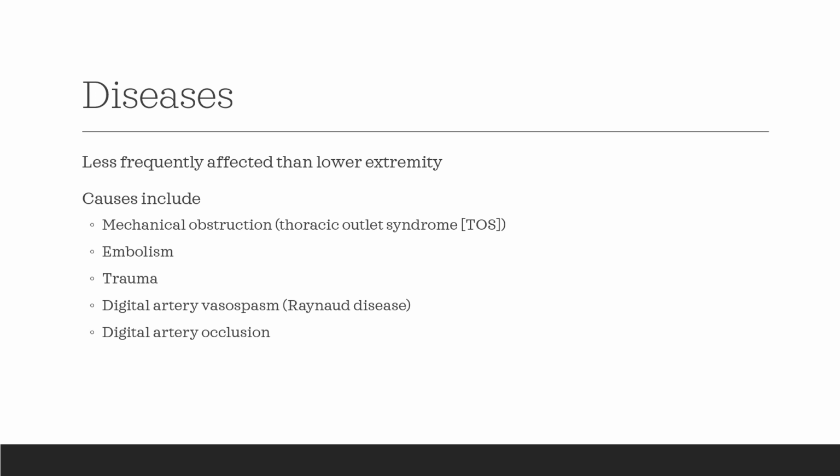And then finally, we're going to be looking for digital artery occlusion because, of course, if an artery is occluded, then we're not able to provide blood flow to perfuse the tissues adequately.